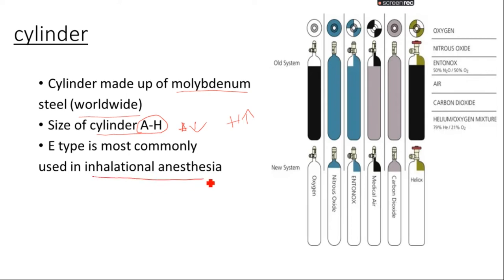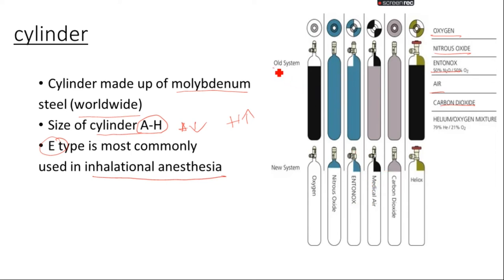Here you can see there are various gas types such as oxygen, nitrous oxide, Entonox, air, and carbon dioxide. The older system had a slender cylinder structure, but now according to the new system the design for oxygen and nitrous oxide cylinders has been updated.